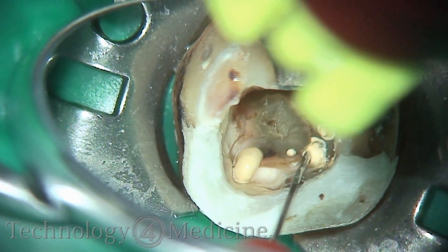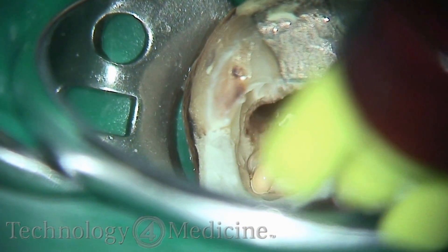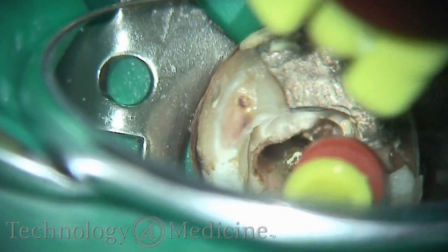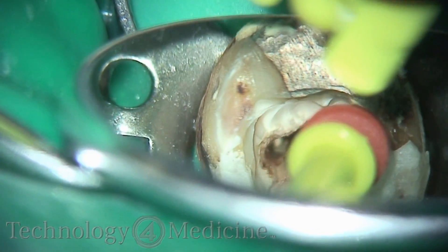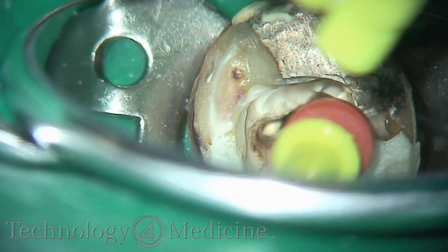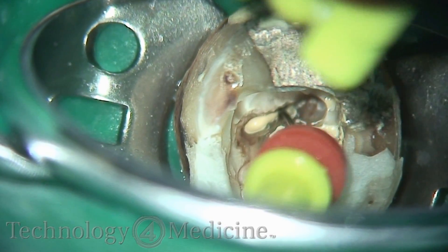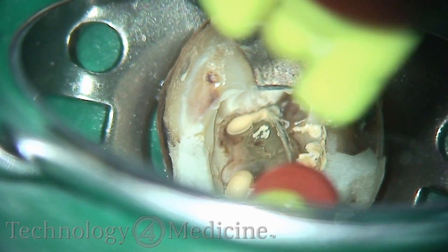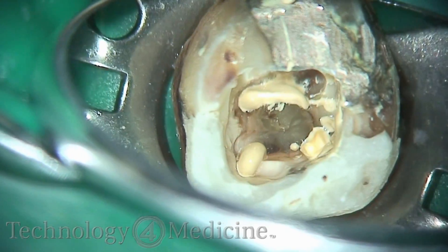I had the same phenomena happen in the distal canal and it just blew me away the first time I saw it — I was astounded, because I had never experienced that with conventional flushing methods. When I started using the laser and PIPS, this became routine. If I don't get this, I'm a little worried I haven't got the system cleaned out properly. Notice I say 'system,' not 'root canal,' because it's a system and I want to clean it out totally in three dimensions.